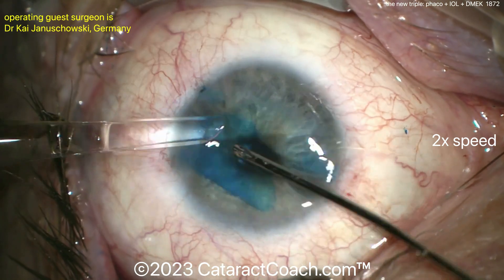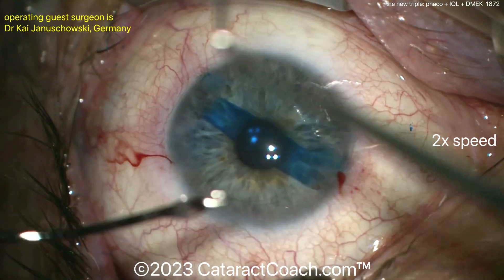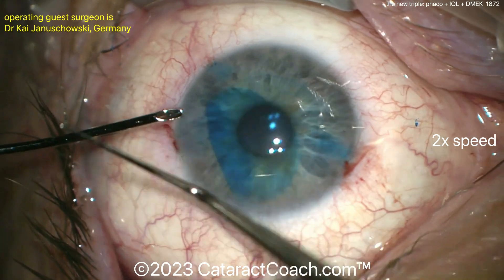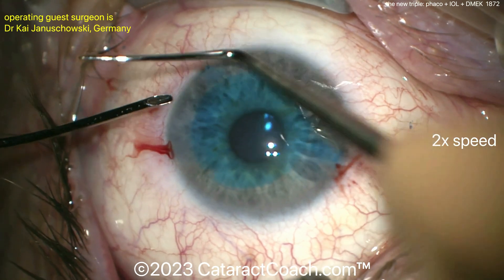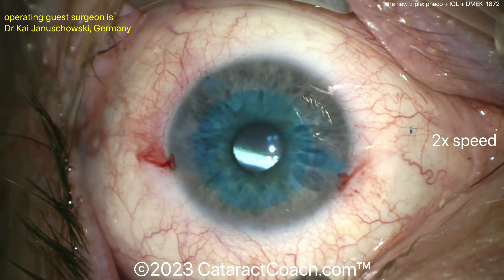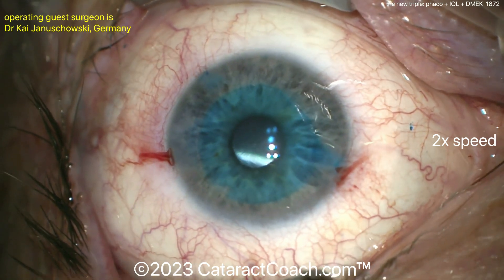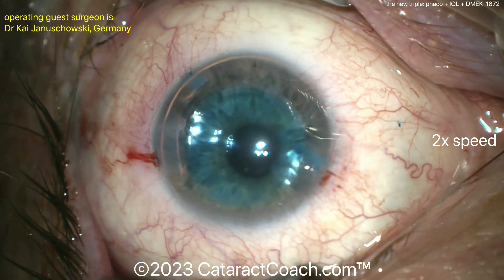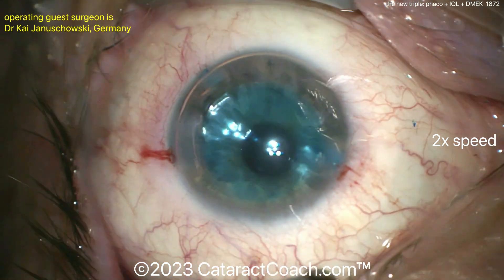This is a very challenging thing. It looks easy in expert hands, but learning how to tap this correctly and get the graft to unfold — there's a great video from a doctor named Veldman from University of Chicago who explains everything; he is a master of it and you can learn those configurations. Wow, there it is — nicely placed in just about a minute. Time for a little gas bubble and seal up the incisions. Impressive. Great video, thanks for sharing. And by the way, I'd put a suture in that incision.